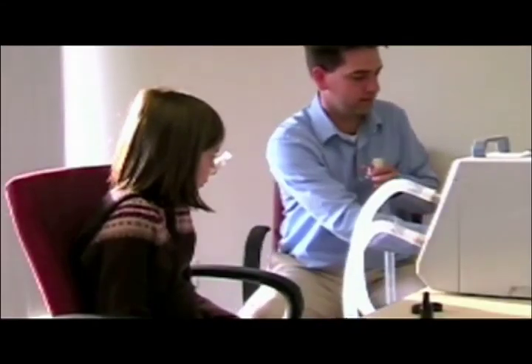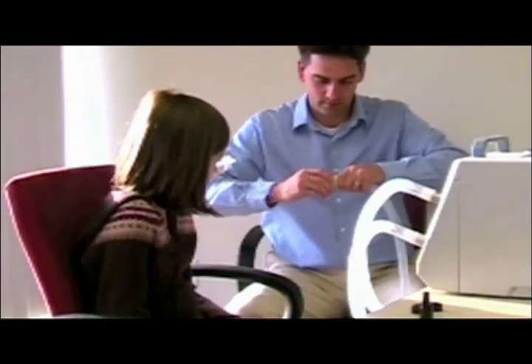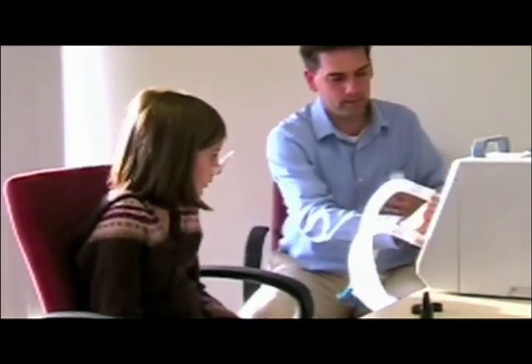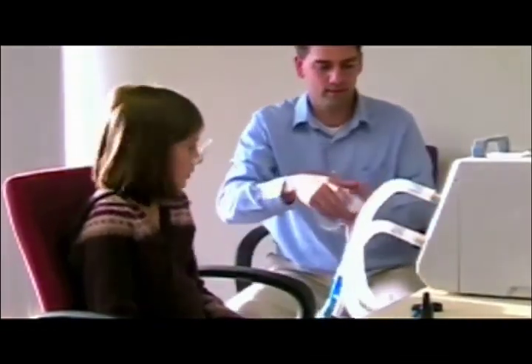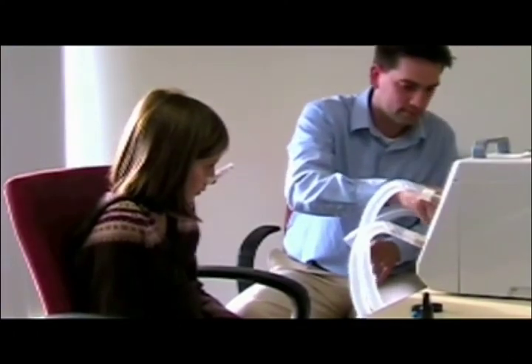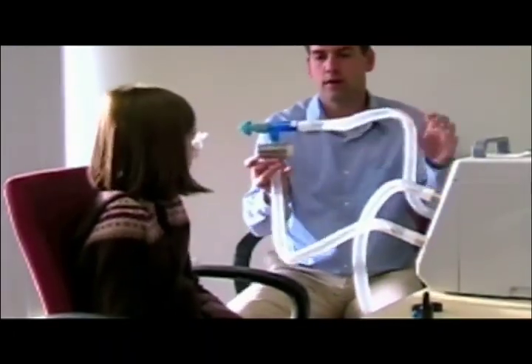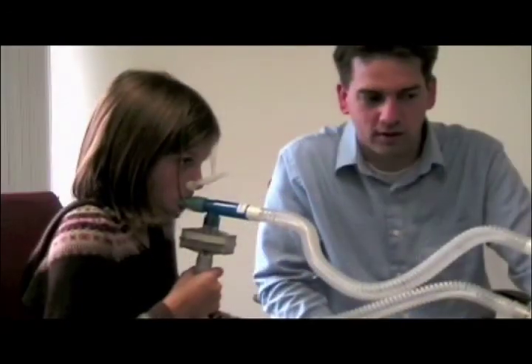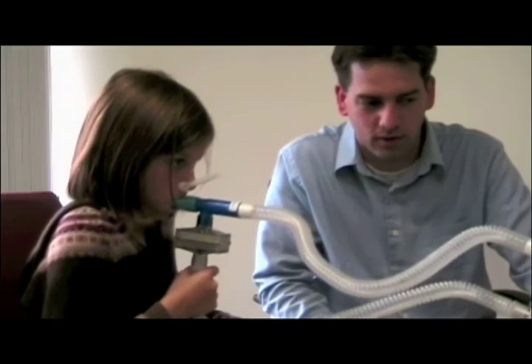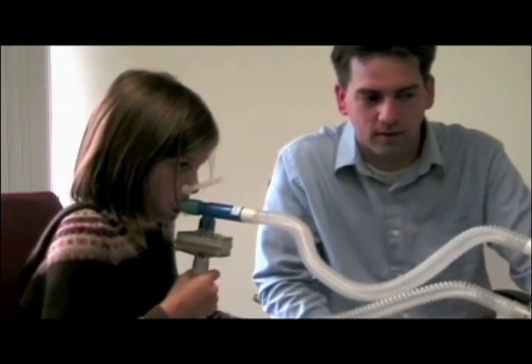After completing the particle counting section, study participants who are feeling ill will be asked to breathe onto a filter so that the content of the particles they exhale can be investigated. For this test, a new tube is connected from the disposable kit to a different port on the ExhalAir machine. Once ready, the user will be asked to take three normal breaths, followed by a deep breath in and a deep breath out. Then they repeat the three normal breaths and one deep breath in and a deep breath out. The user will keep repeating this pattern until ten deep breaths are completed. This section typically takes an additional three minutes.